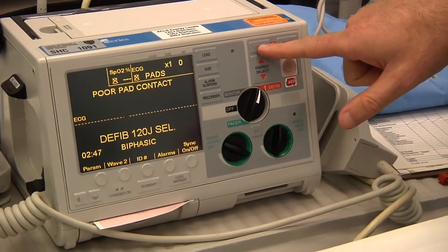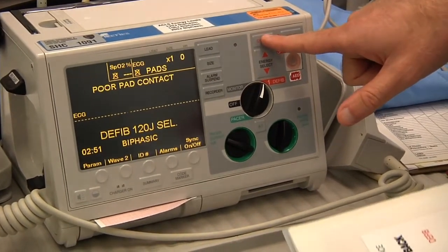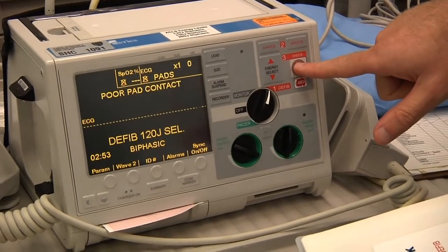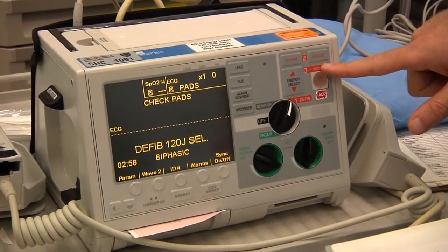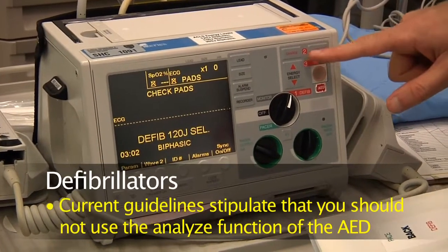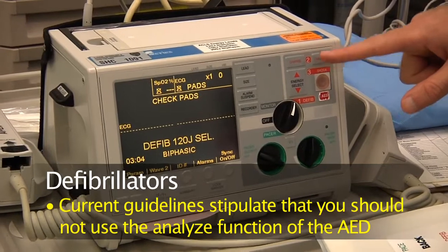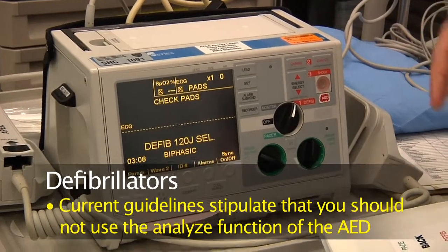Then I will charge it, and when it's fully charged, I'm going to clear the team, and you're going to defibrillate here. Now you'll notice there's an analyze button here. This does have an AED feature in it, but once again, current guidelines say you should not use the analyze button unless you are absolutely uncertain or feel uncomfortable. As a code leader, you should know whether or not it's a shockable rhythm.